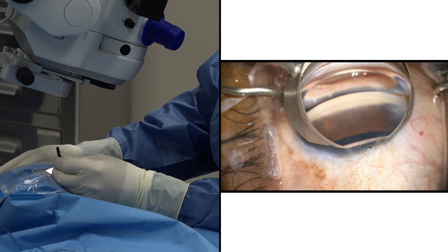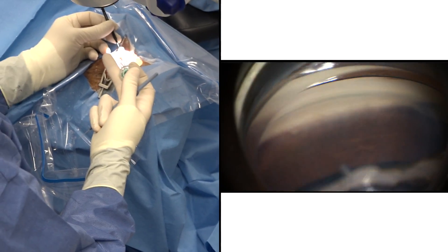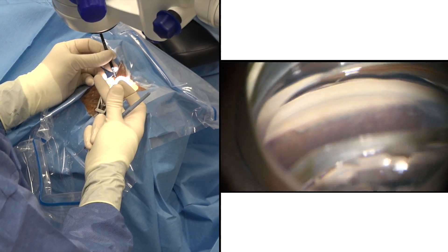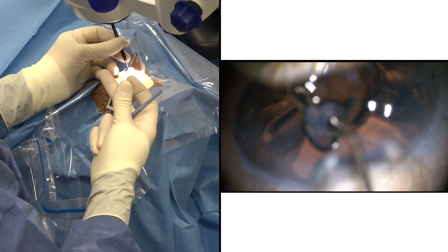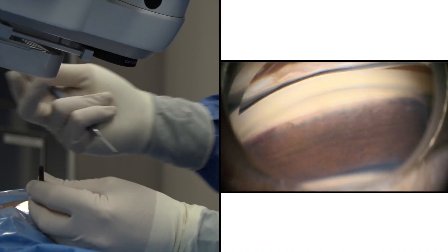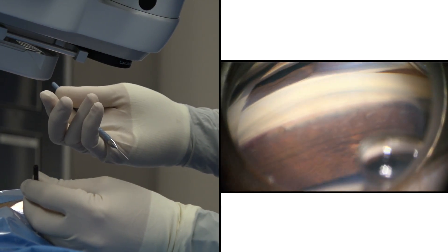So here we have a good view of the angle. We see a few PAS from argon laser trabeculoplasty but nice blood reflux into the canal, and we're ready now to bring the dual blade into the eye to open up the canal of Schlemm.